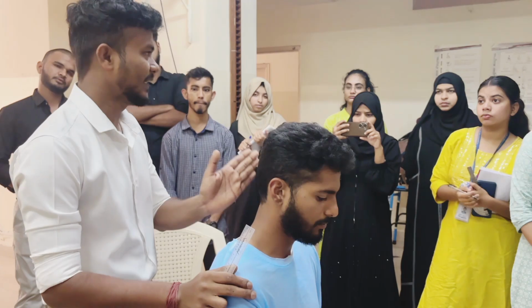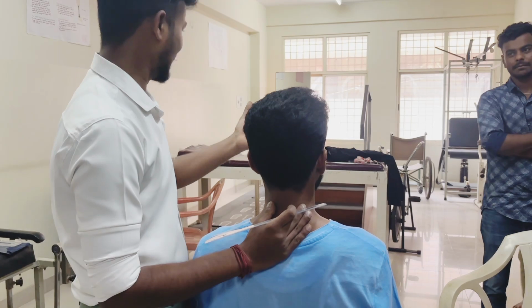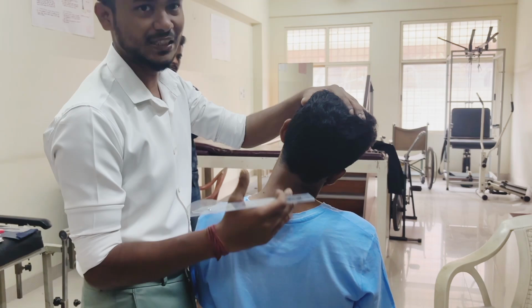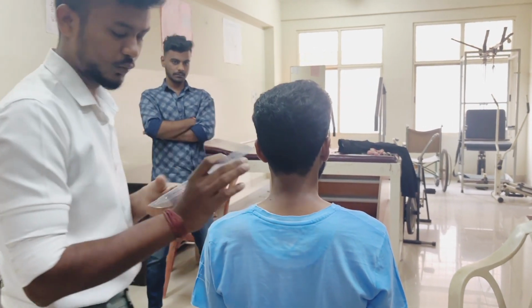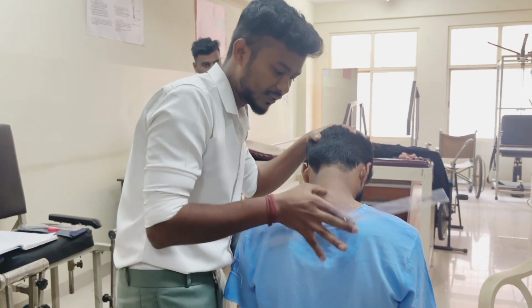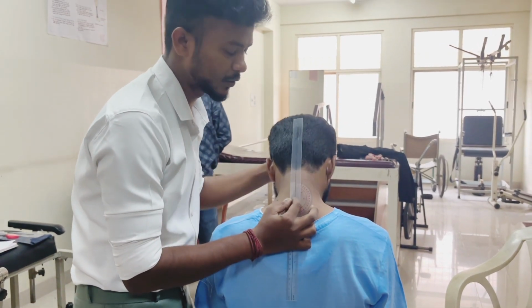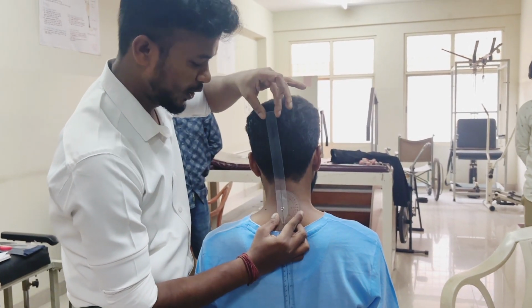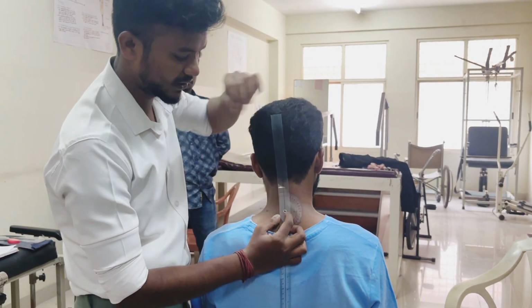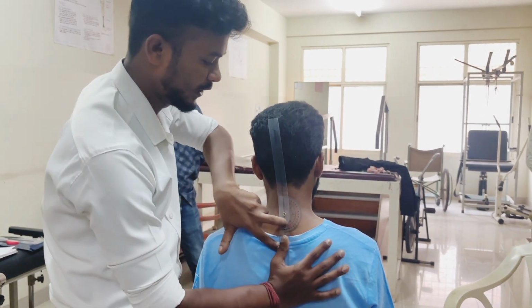Now we will see side flexion and rotation. This is our lateral flexion. First we will do the lateral flexion movement passively, so the patient will understand what lateral flexion is. After that we take the fulcrum. The fulcrum will be over the spinous process of C7. The movable arm will be at the center of the head, posterior, and the stable arm over the spinous process of the thoracic spine.